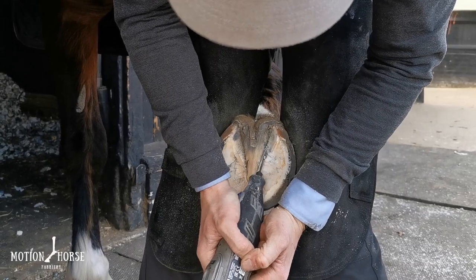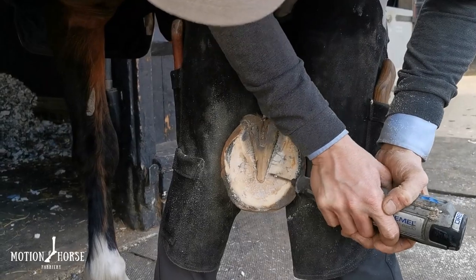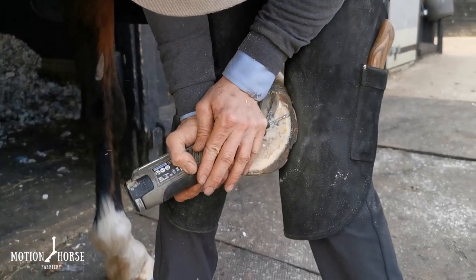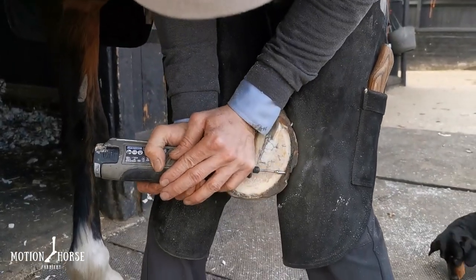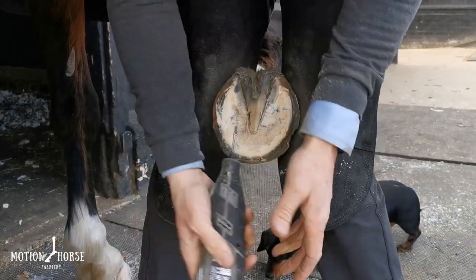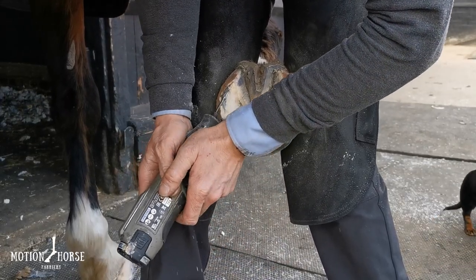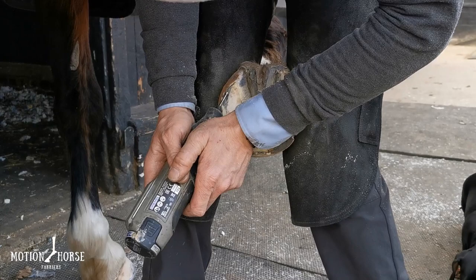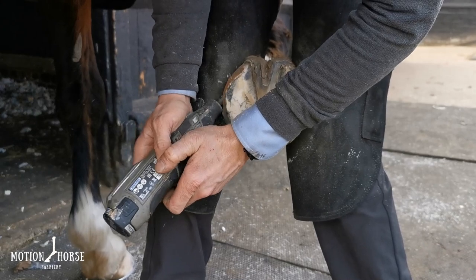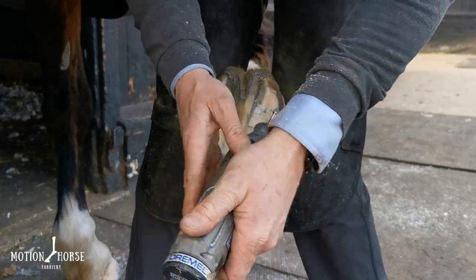I'm using the Vetek Equipack for this — it has very good adhesion to the sole. We've also used this on a lot of endurance horses and found it to be the best one for adhering directly to the sole without the help of anything else. The reason I do it this way is that depending on the event, surface, or terrain you're competing on, you can remove the pad if needs be, or prep the foot and add the pad depending on your preparation for that competition.